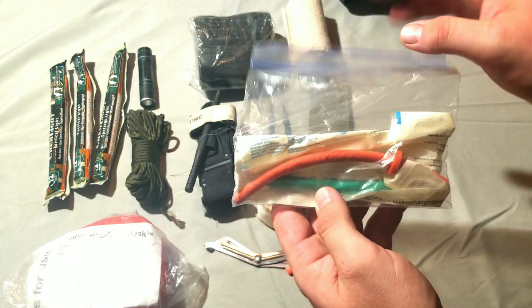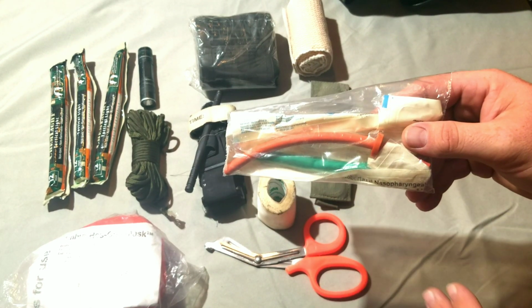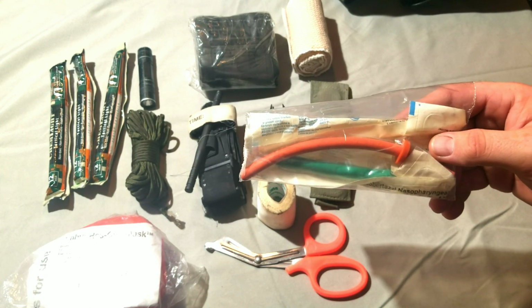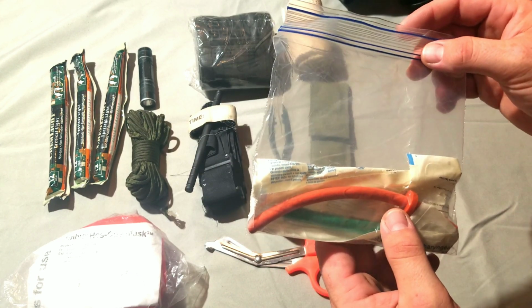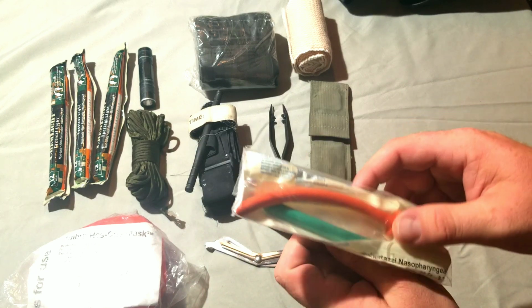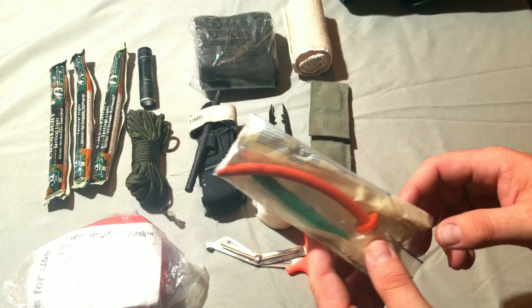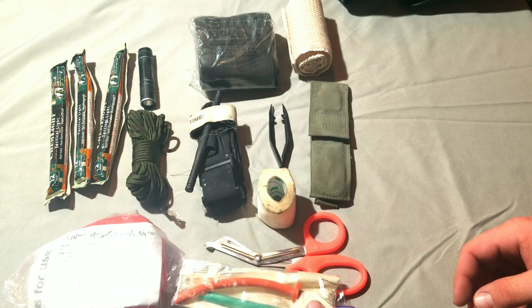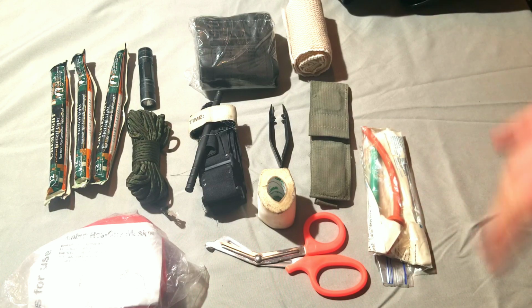So once again, this is kind of getting on the level of, you got to know how to insert this. So it's a good way, if the airway is blocked and stuff like this, you can insert it down the nostril and it allows you to open up the airway. But once again, this is one of those items that if you're not trained on it, it probably does you no use to have it. So you can take that space and put it with anything else, regular Band-Aids and stuff like that. Maybe some more glow sticks or more Band-Aids and maybe another ace bandage.